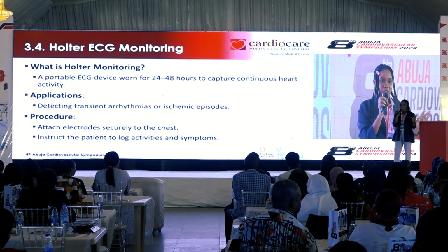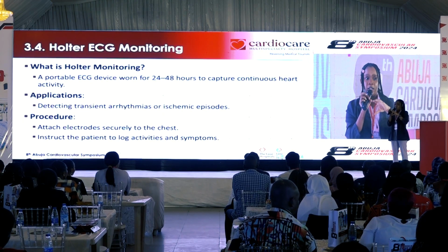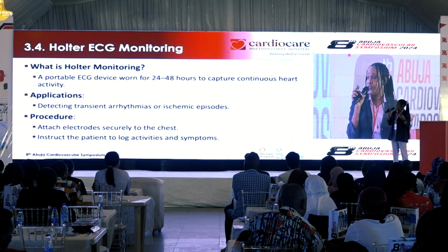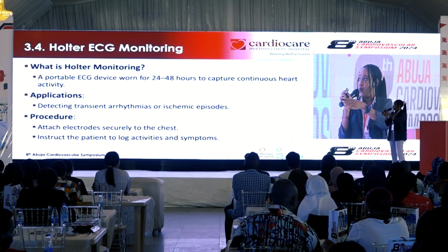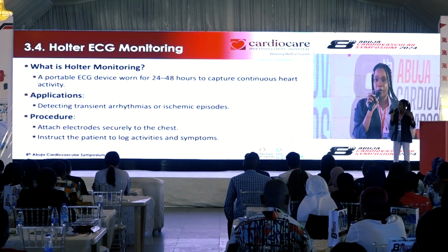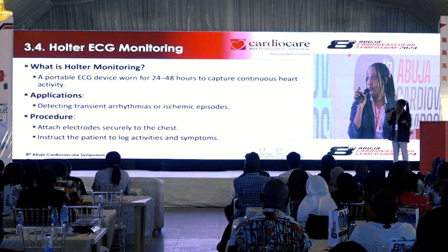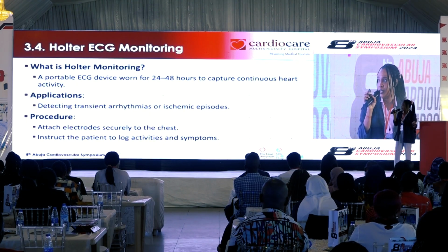It's well detailed, but it runs for just 1 minute. And sometimes when they come in, whatever they're complaining of, you might not pick it on the ECG. So it's advised that they fix the 24 to 48 hours device. They take it home, they come back, then we report it. So it's used to detect transient arrhythmias and ischemic episodes.